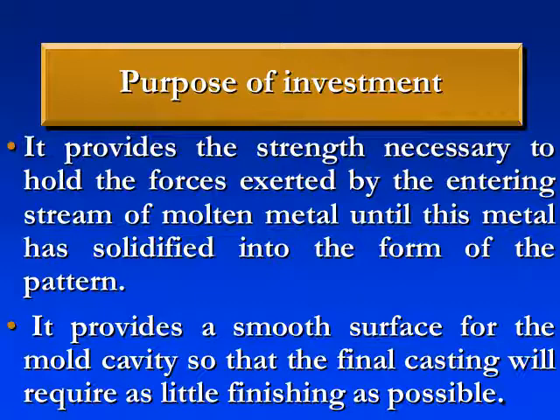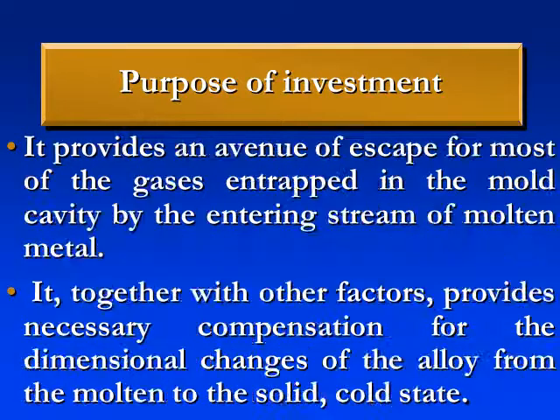Also, the investment material provides a smooth surface for the mold cavity, so that the final casting will require as little finishing and polishing as possible.